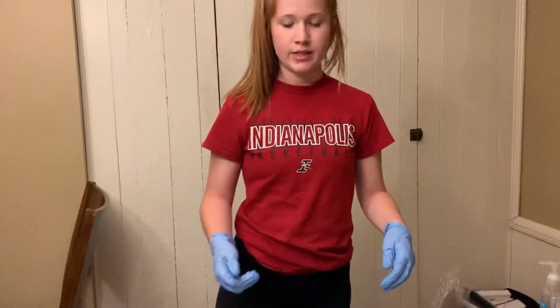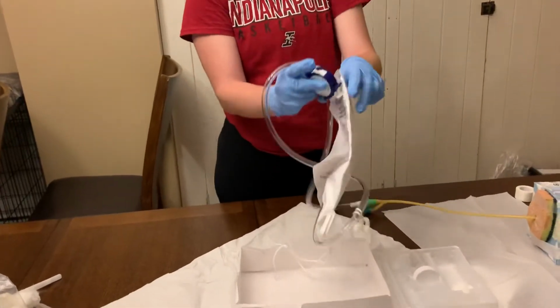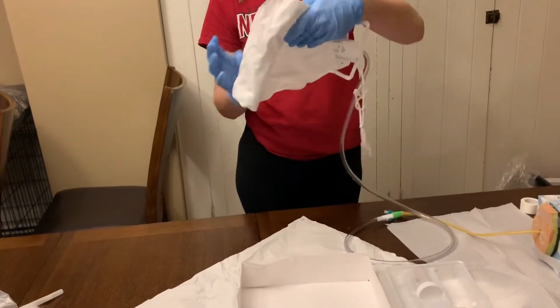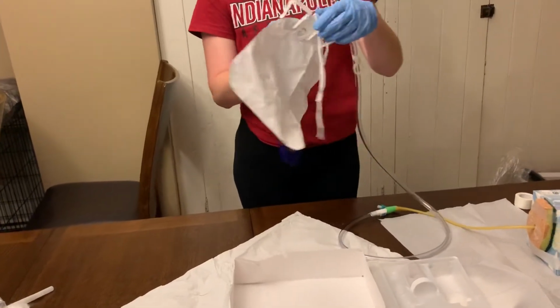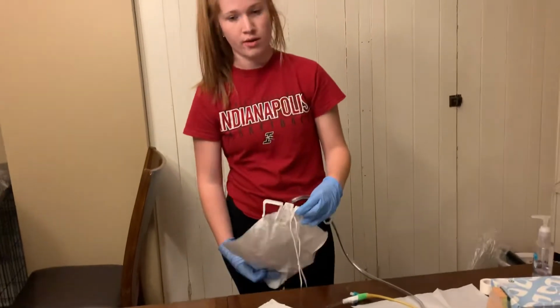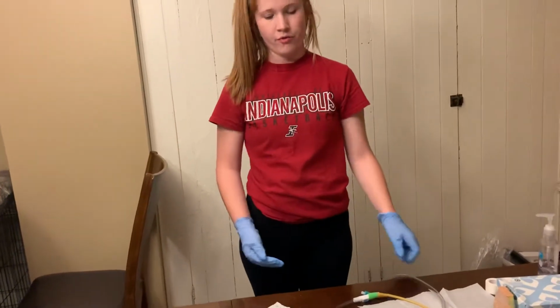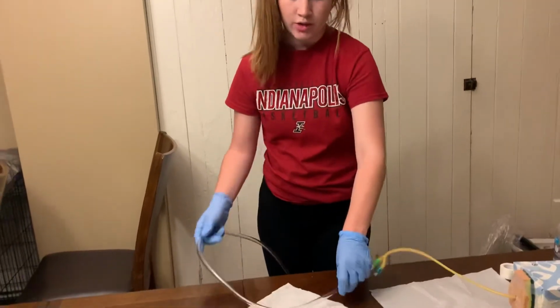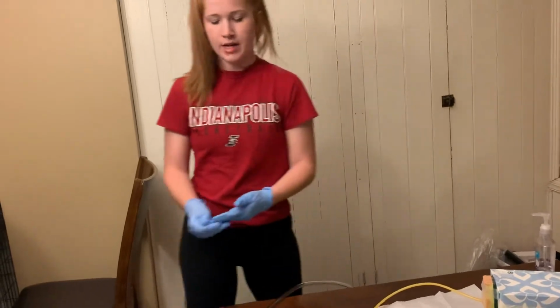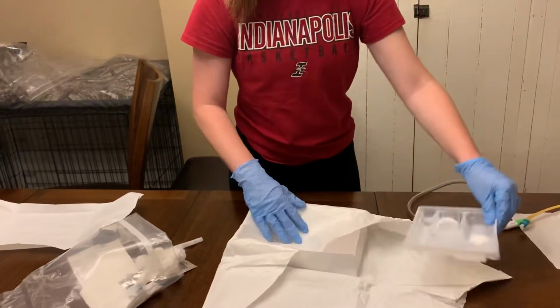Also, I'm going to take the collection bag and I would place this on a non-movable part of the bed below the bladder level. I'm just going to set it on a surface I have down here for the purposes of this video, and then I would ensure that there was no kinks or anything in the tubing. Now that I have that done, I can go ahead and discard of my supplies.